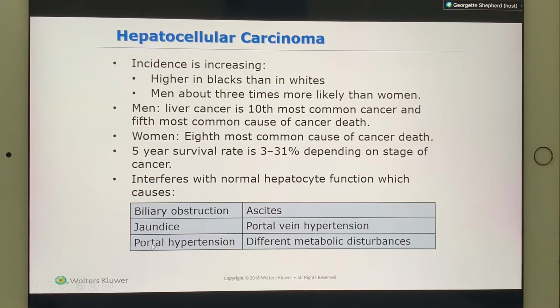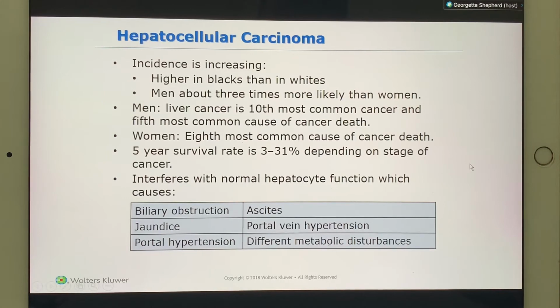What's our sonographic measurement for portal hypertension? Greater than 1.3 centimeters. 1.3 centimeters. Okay. So when you make that measurement, be very, very careful that you're not giving them a diagnosis that they don't have.